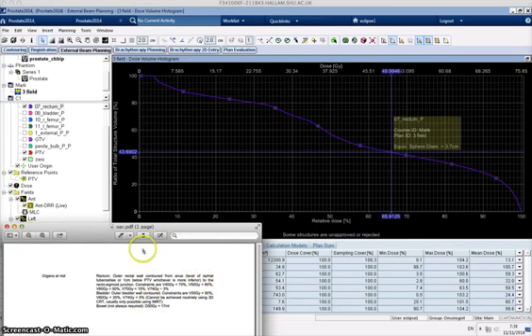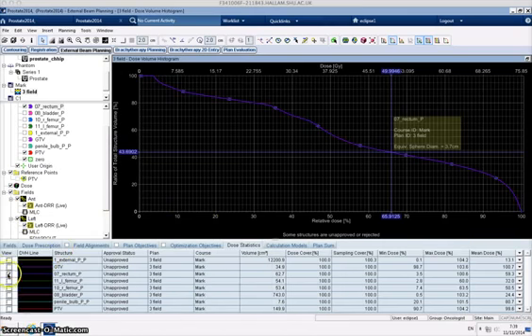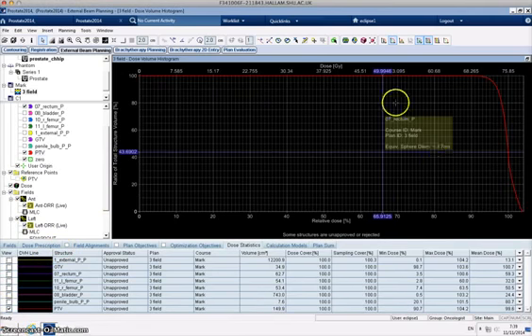So we would work our way through these lists of constraints to see if we're meeting those, and I'll leave you to have a think about how you would do that for the rest of them. But in terms of dose to the PTV, you may well see on a clinical protocol that it talks around the D98 or the D50 or the D2, and so we're talking about how much 98% of the PTV is getting, how much 50% of the PTV is getting, and how much is 2%.